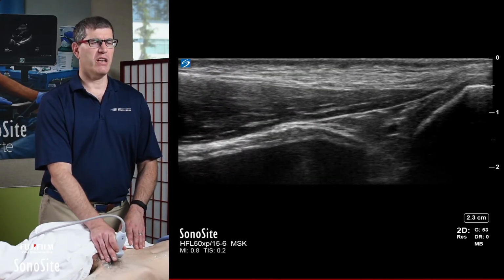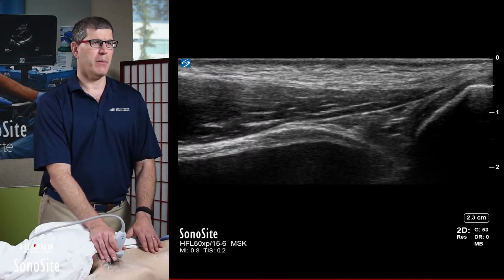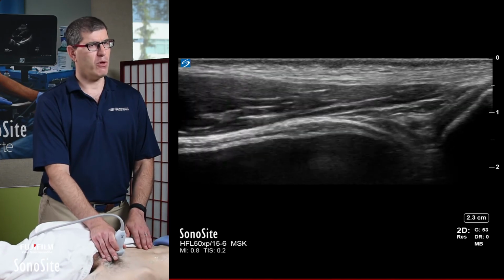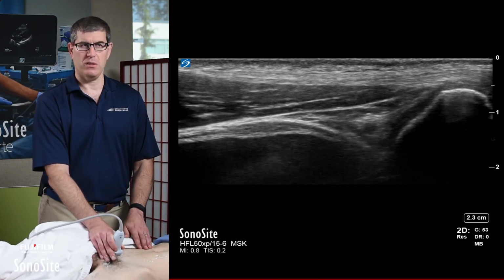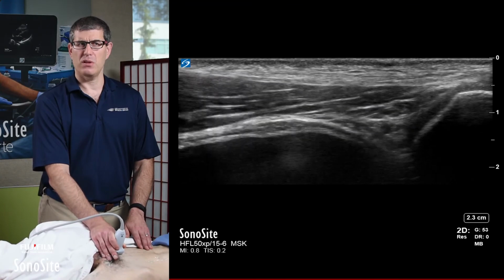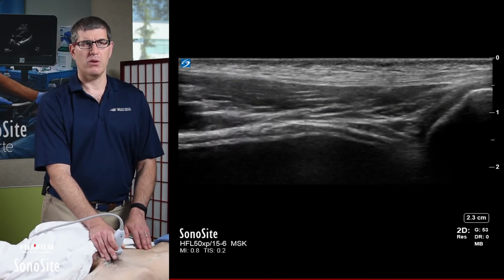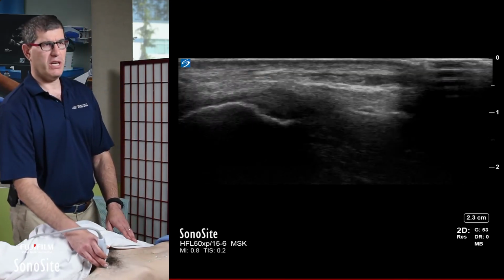One of the things you want to do is take advantage of doing a dynamic exam. So let's just once more have you do a stomach crunch. I'm looking at where the rectus abdominis is attaching. Let's do that a few times and see if that reproduces the symptoms. Okay, now I'm going to go a little bit more distally.